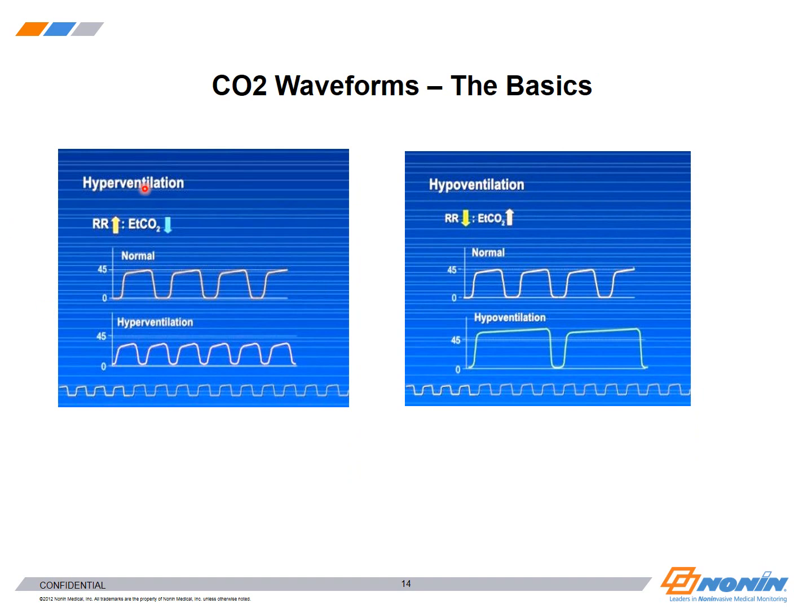Just some examples of what hyperventilation and hypoventilation would look like with waveforms.